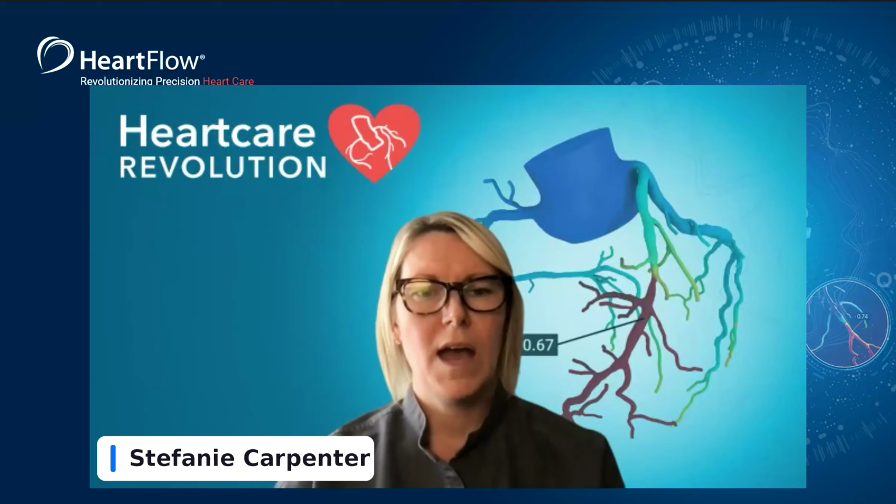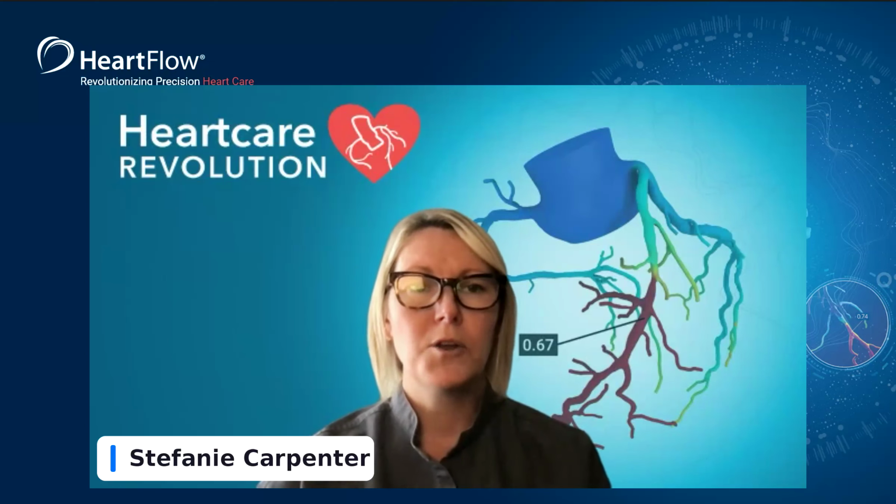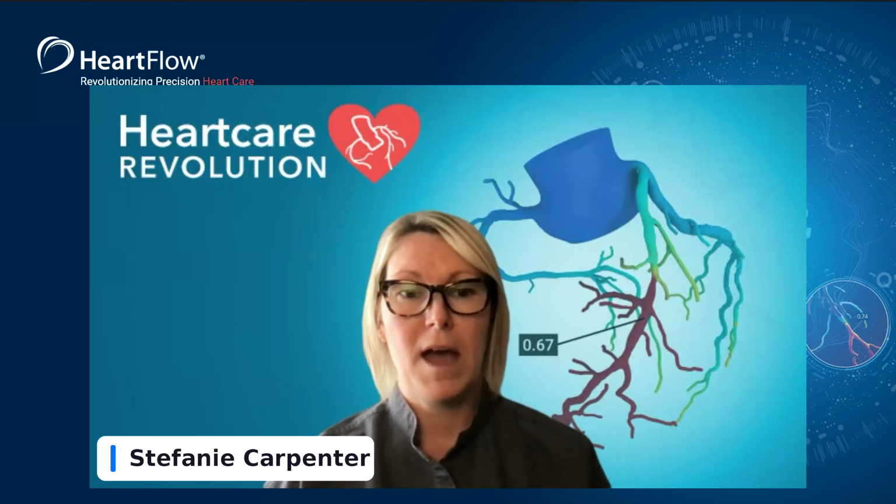Yeah, so how high should you cancel? That's not a question that we're ever going to be able to answer. We're always going to defer you to whoever your imaging champion is. So if it's a radiology or cardiology reader, you're going to want to talk to them and have a discussion per site, per customer, like when do we want to call a case? Obviously it's going to be different depending upon your scanner and your scanner technology. We have seen successful scans at 70 beats per minute, again, depending on the scanner that you have and the conditions that you have.